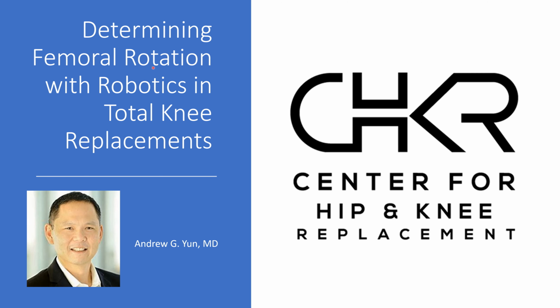So that was a deep dive into femoral rotation, and again, remember, the whole point of determining femoral rotation is so that the patella and femur track well and that you have a balanced flexion gap. We use landmarks ahead of time to try to achieve that. The landmark itself does not represent proper rotation. The landmark is used so that you can achieve proper rotation. So remember that distinction. Thank you very much.